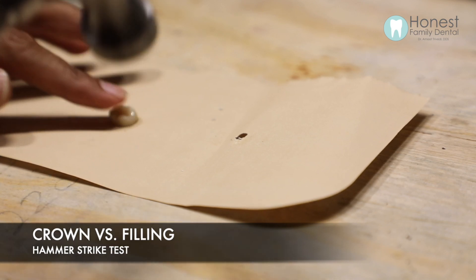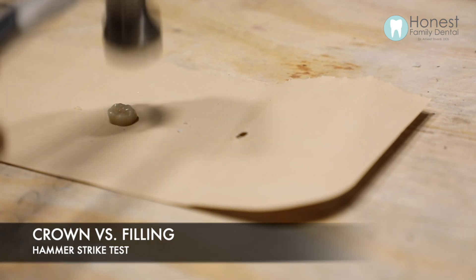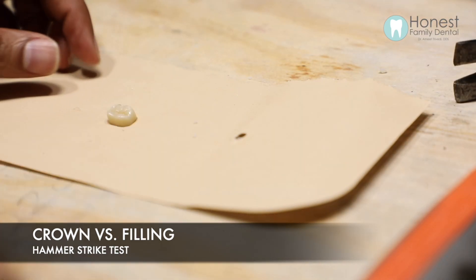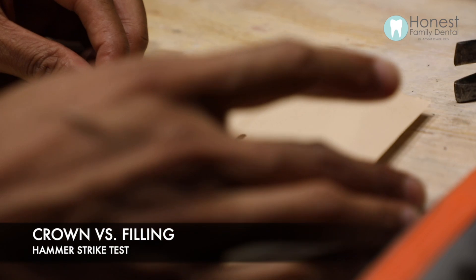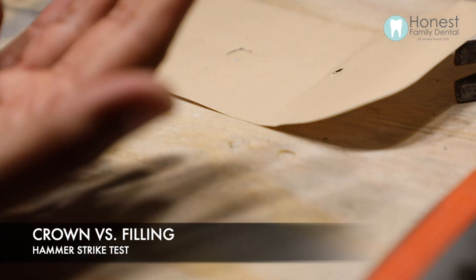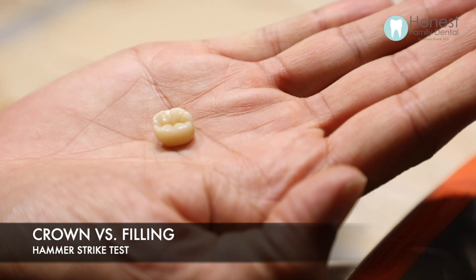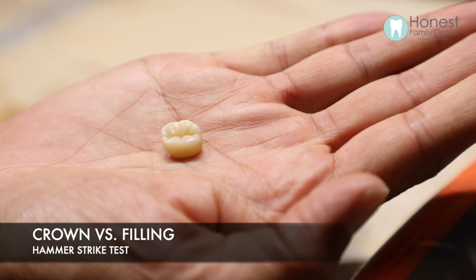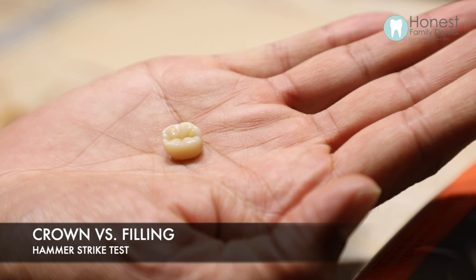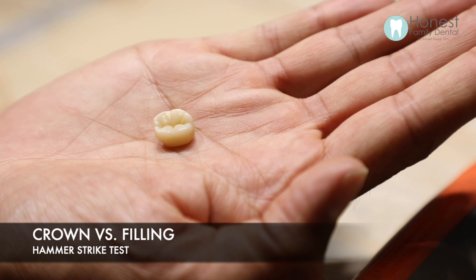Now let's try the crown. No matter how many times I hit this thing, it's not going to break or shatter — it dug itself deep into the wood. Taking a close look, we can see the crown has not flaked, shattered, or etched. There's absolutely no damage to it other than a small discoloration on top from the metal of the hammer.